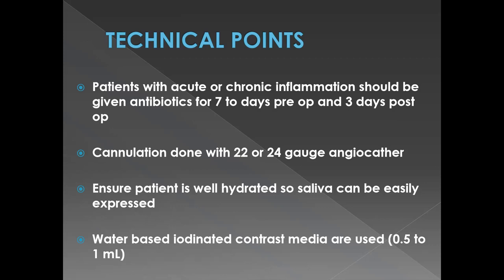All right. The reason being that the gland is already inflamed, and whenever you're injecting contrast into the gland, that can cause spread of the infection towards the hilum or even into the body of the gland. And there is slight discomfort whenever you inject contrast agent.